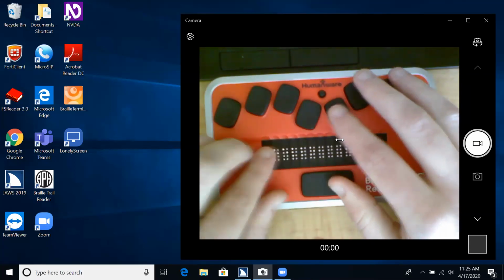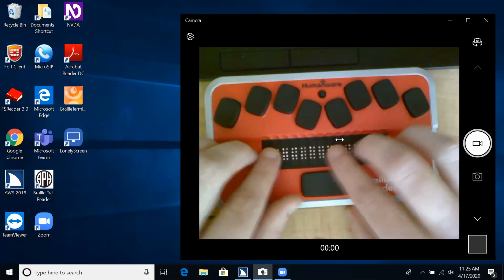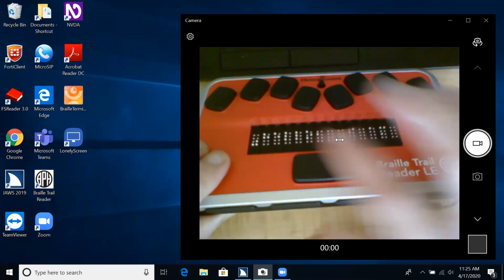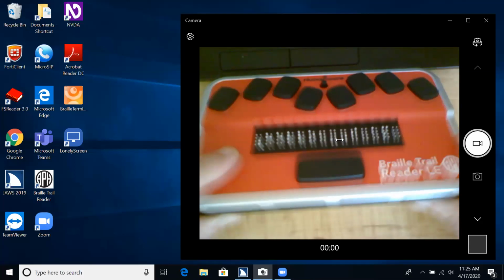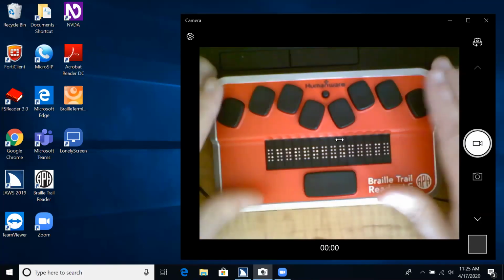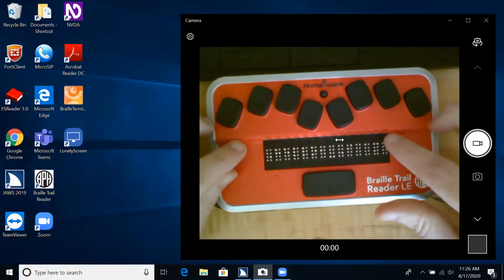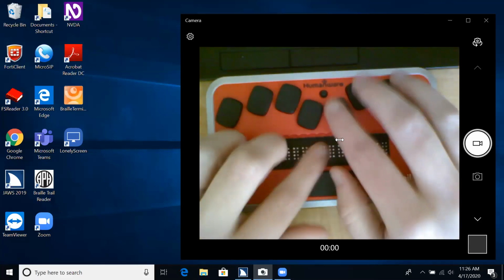Again, very basic commands, but they allow us to start to drive home that concept of moving the cursor around, both with commands as well as then being able to employ the cursor router technique of routing my cursor. And with that, what's very important, you do receive a vibration when you route that cursor if you want to. So you can turn that on and off, and that will be very useful. So you can have that haptic sort of feedback in addition to having the cursor appear. So again, just another way to do that.